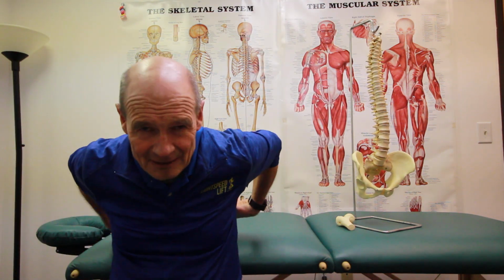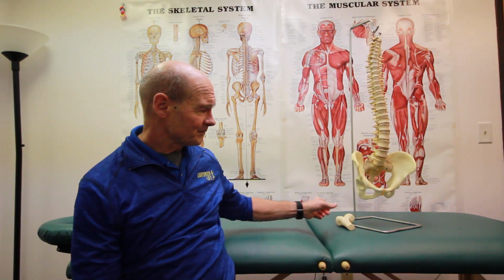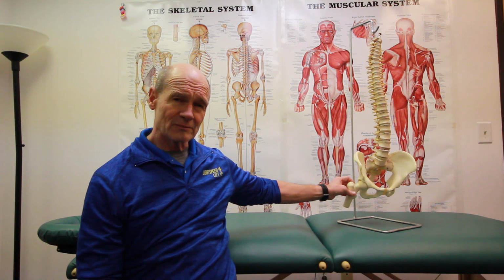Finally, in about 2009, I had a paradigm shift and came up with an idea of attaching elastic cords in front, down through the hips, up behind a person, to a frame that fit around a treadmill. It didn't actually attach to a treadmill, but fit around a treadmill, so that it was inexpensive and could fit within any kind of rehabilitation clinic. And we worked really hard to make that system stay right in place there.